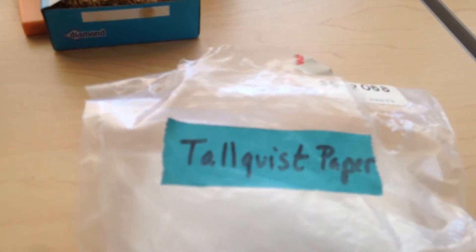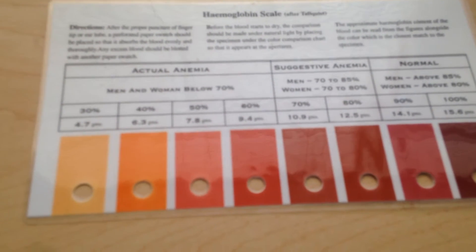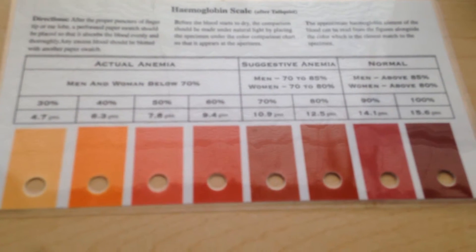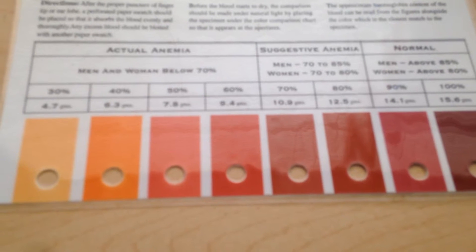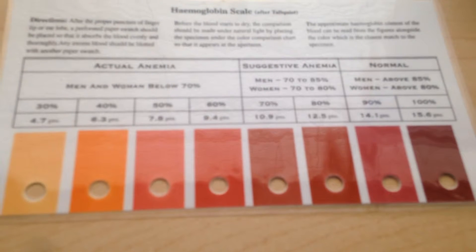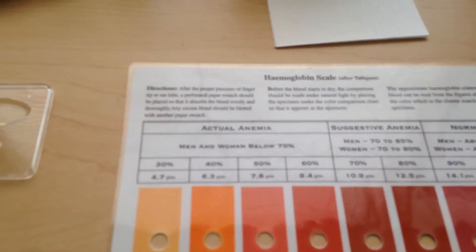Then we will do the hemoglobin concentration. For hemoglobin concentration we use the turquoise paper. You will also need this hemoglobin scale — it has different colors — and you will match the color of your blood on the turquoise paper with the colors on the scale to determine your hemoglobin concentration.